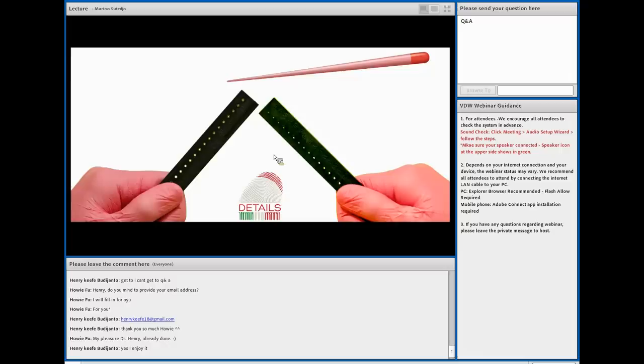So once I take my gutta percha 4% taper, I take 25, I put it on my working length and I check. If I don't have a good enough apical stop with my 25/04 taper gutta percha inside my 25/06 instrumentation, then I'm going to resize my gutta percha to one size larger. In this case, it's number 30.